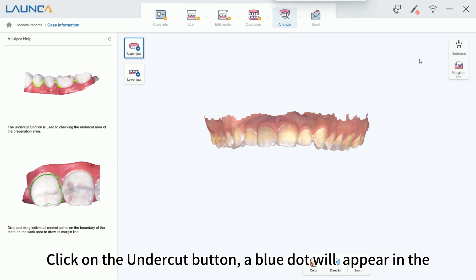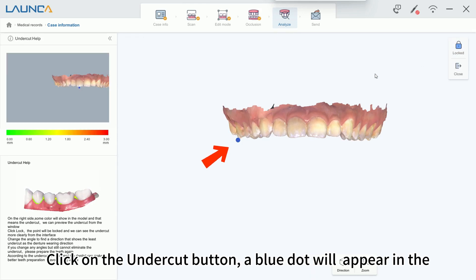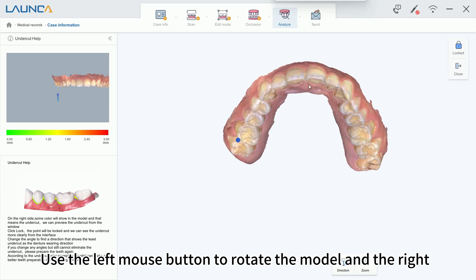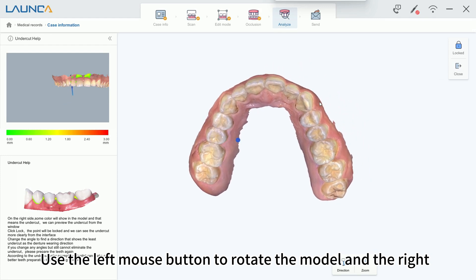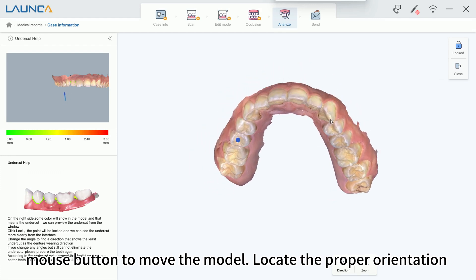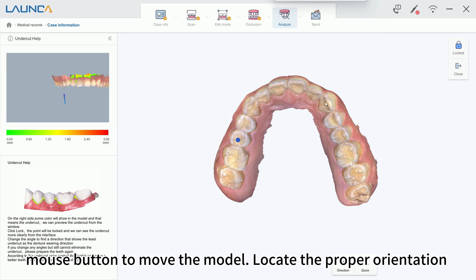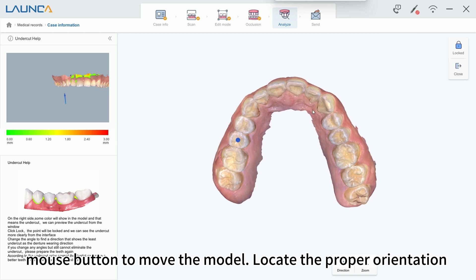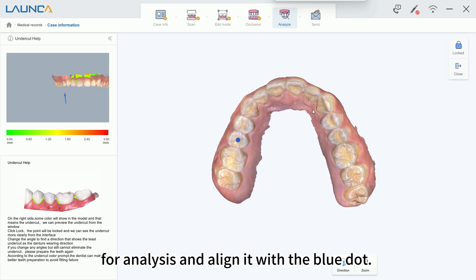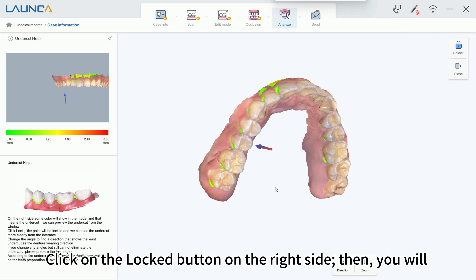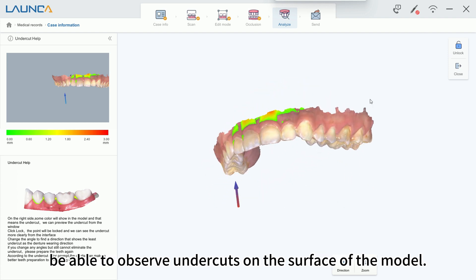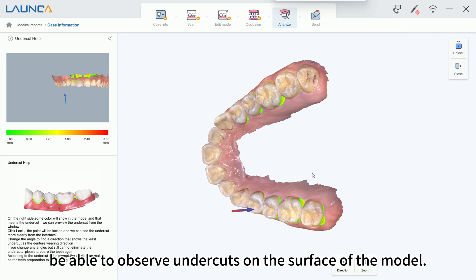Click on the undercut button. A blue dot will appear in the center of the screen. Use the left mouse button to rotate the model and the right mouse button to move the model. Locate the proper orientation for analysis and align it with the blue dot. Click on the Locker button on the right side. Then you will be able to observe undercuts on the surface of the model.